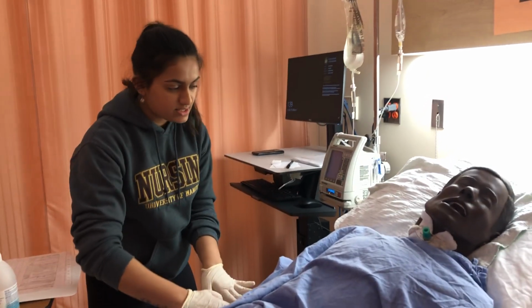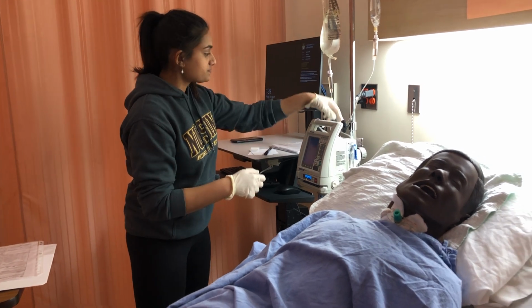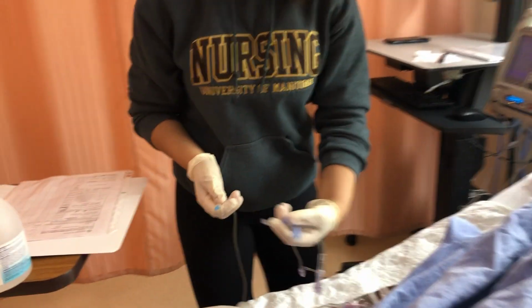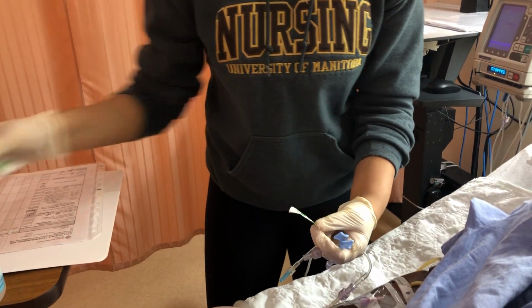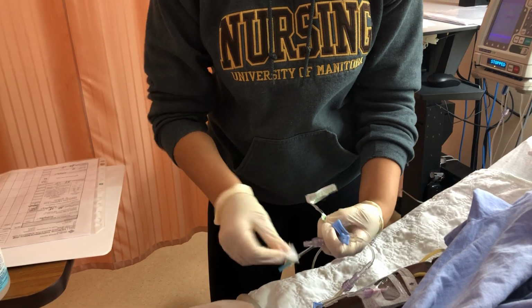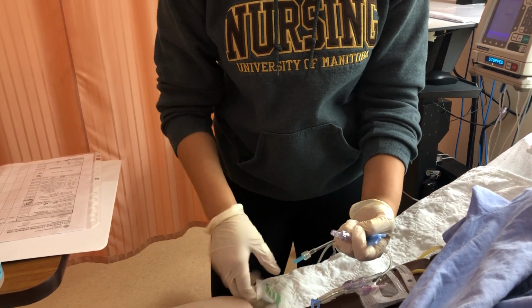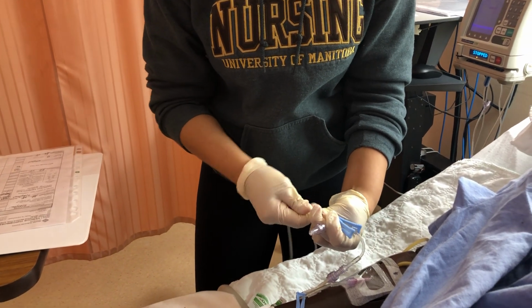Okay, so I'm just gonna assess the site. The patient isn't complaining of any pain, and there's no redness. So I've already done my 3 checks. I'm going to alcohol swab the port for 30 seconds. Let it dry for 15. So let's say I've done that. I'm going to remove this, maintaining sterility.